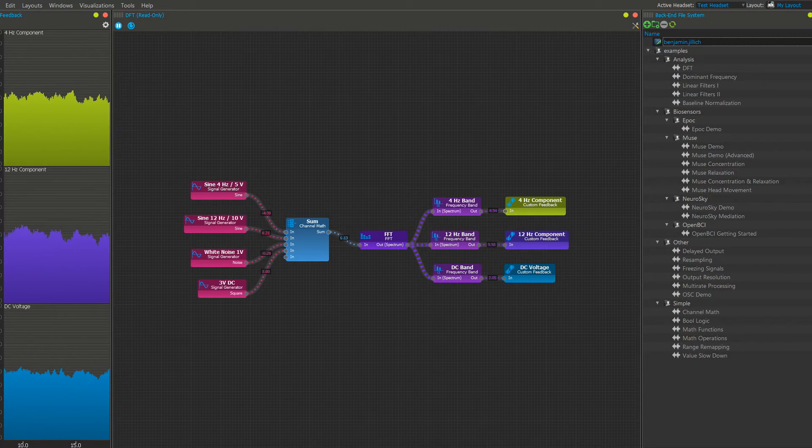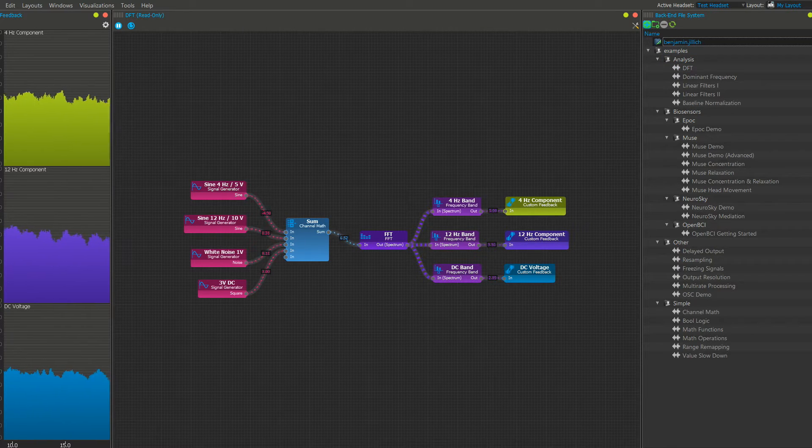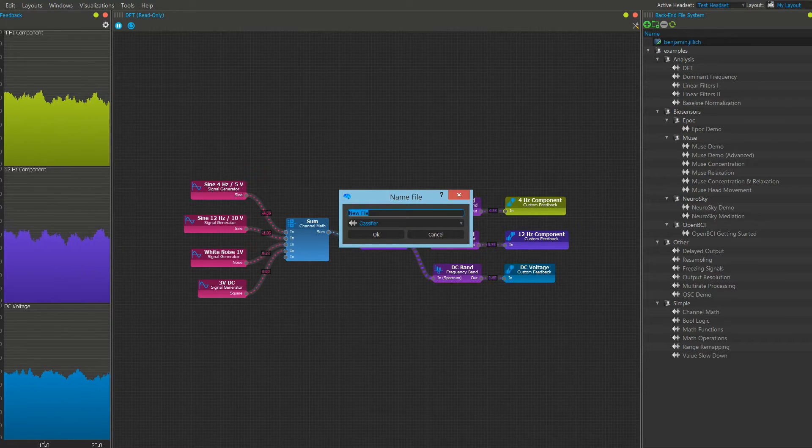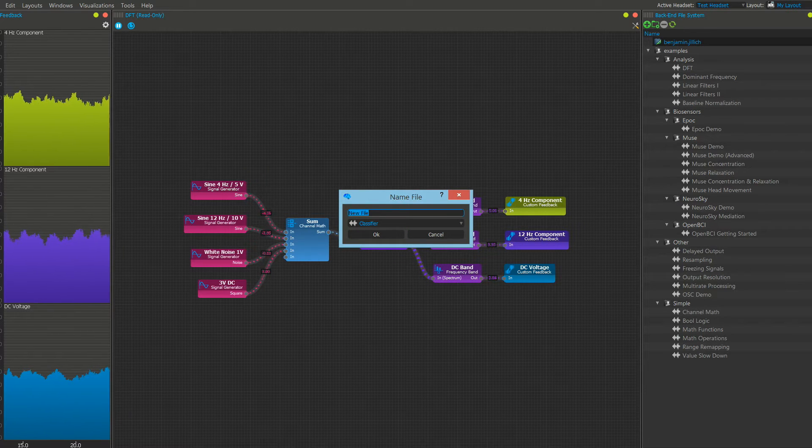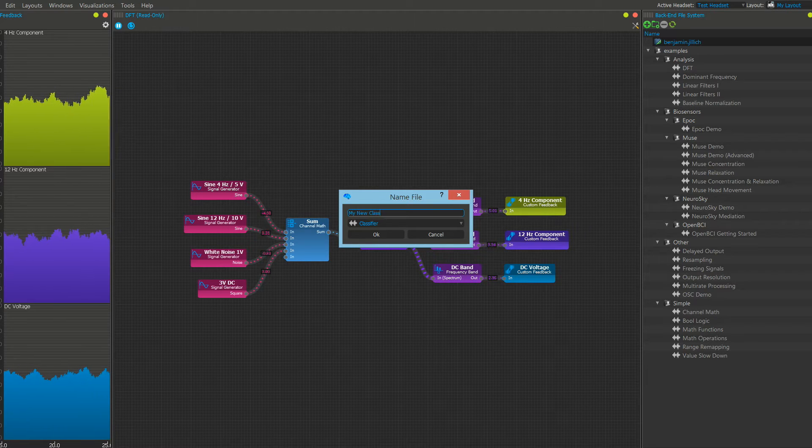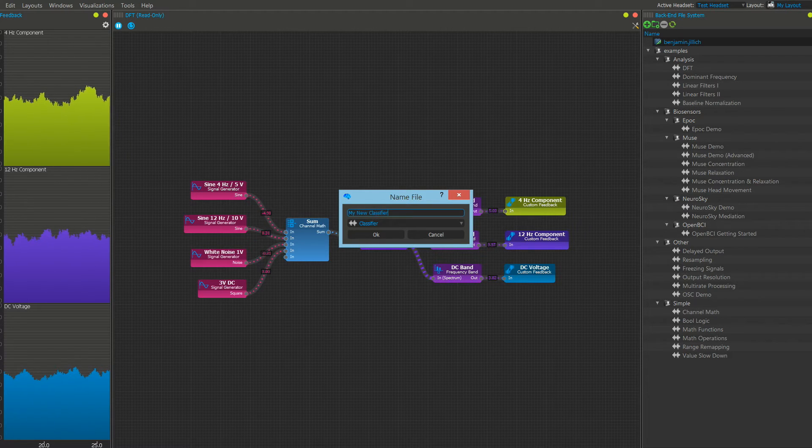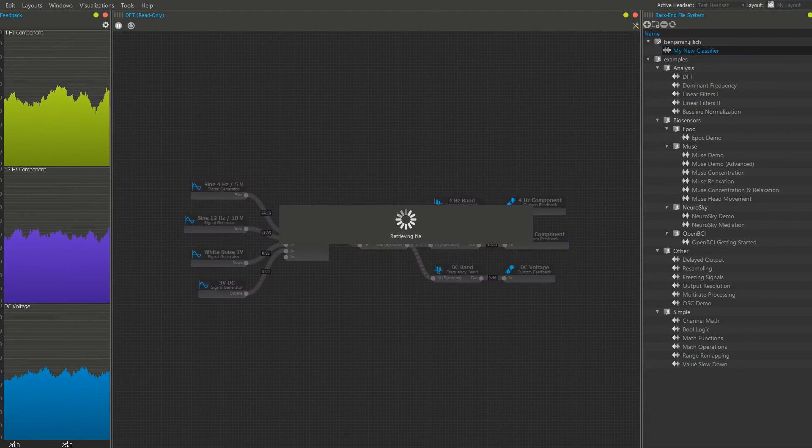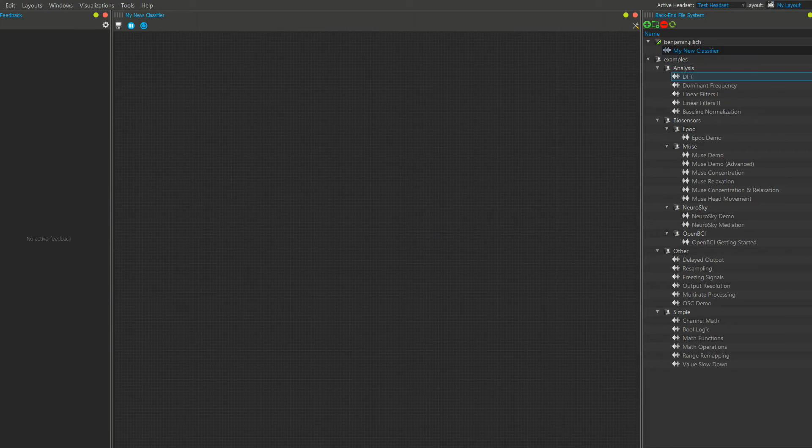We can create new classifiers with a plus icon on the top right. By clicking it, it's going to be loaded.